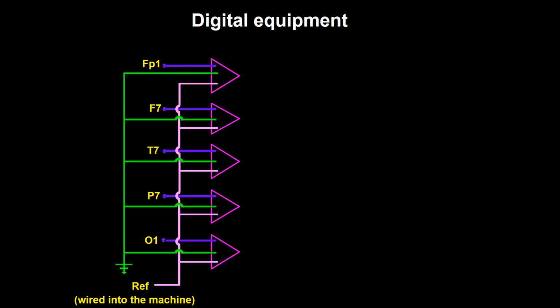In the digital world, this diagram is used in all instances to reconstruct bipolar montage, common referential montage, or any other montage. And this is all achieved by the introduction of a common reference to all differential amplifiers entering through G2. By this approach, a single value is given to each amplifier and thus to each electrode entering through G1.